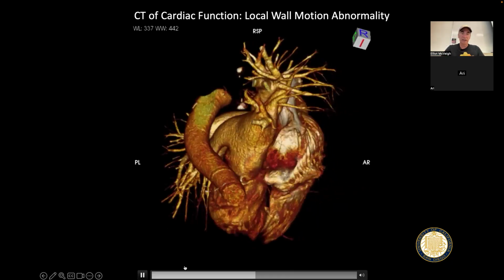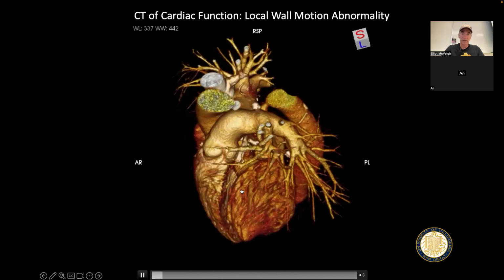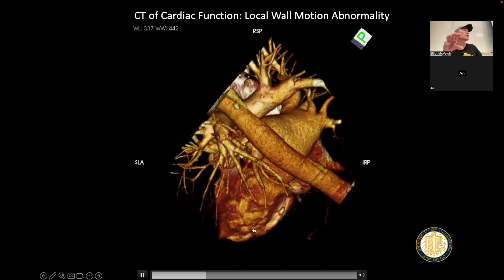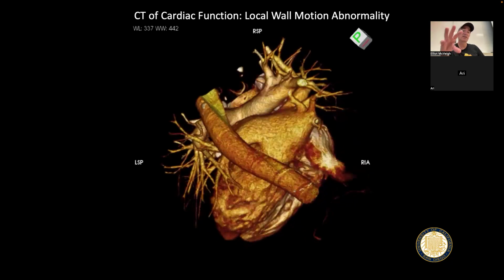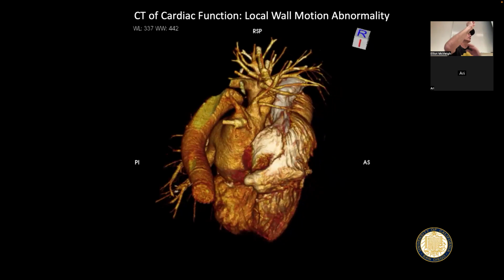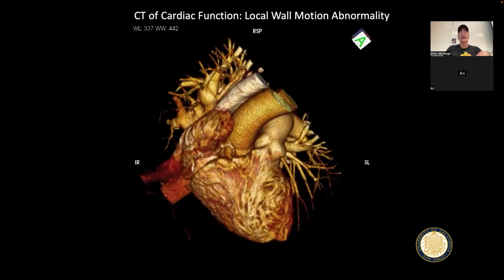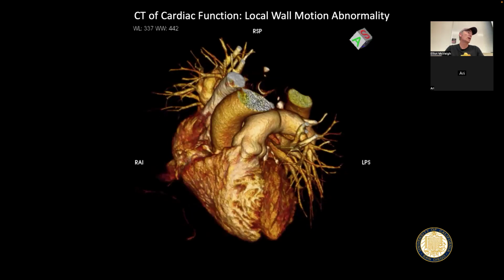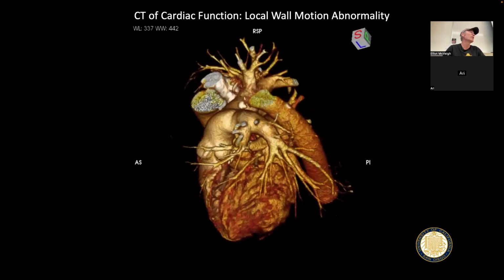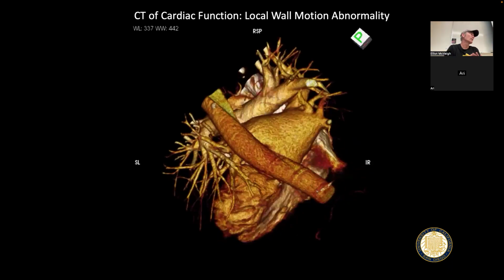If you compare it with the tissue that's here, for instance, see how it's all contracting down together, but then this thing, you can just draw a very precise region around that and say that that piece of tissue is not contracting. It's just sitting there, right? It's getting dragged around, but it isn't itself actively contracting. And so it's trivial to just paint a line around it and say, that's my abnormal spot, right, in the left ventricle. What causes that abnormality is usually either an acute drop in blood flow to that region, or you had that acute drop in blood flow weeks ago and you killed the tissue and now the tissue is actually dead, right? It's just a patch of dead tissue that's being transformed into a scar, right?